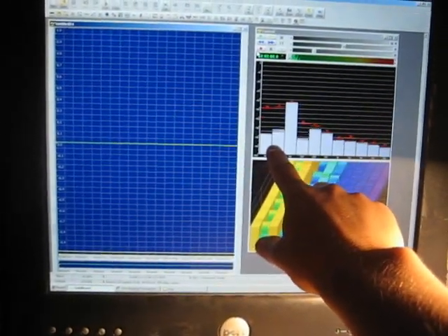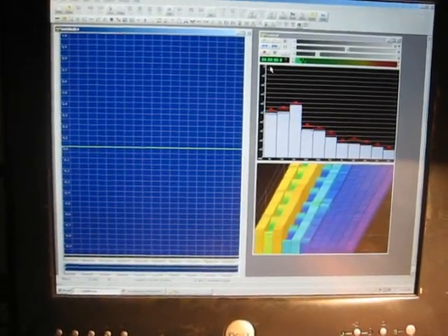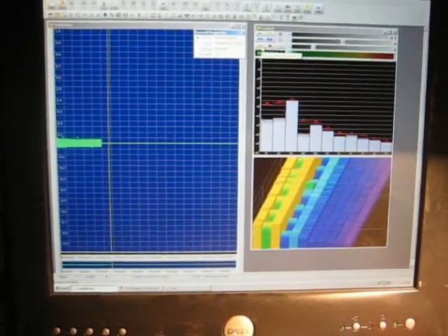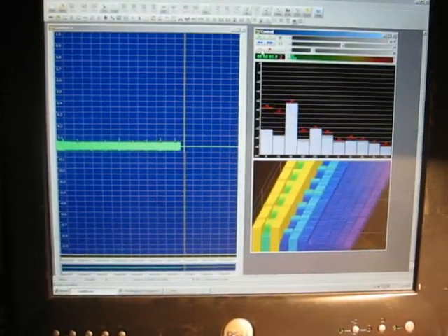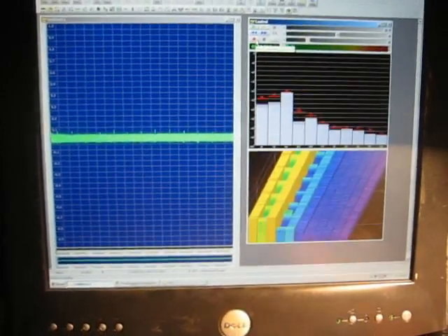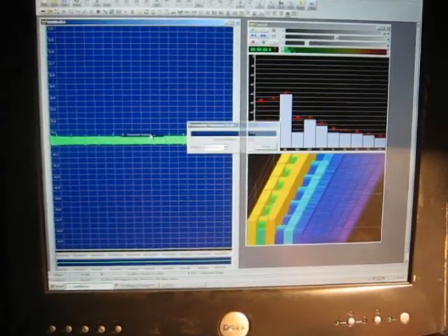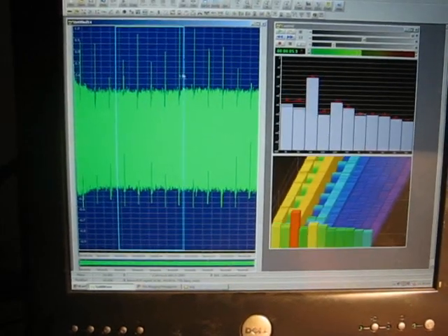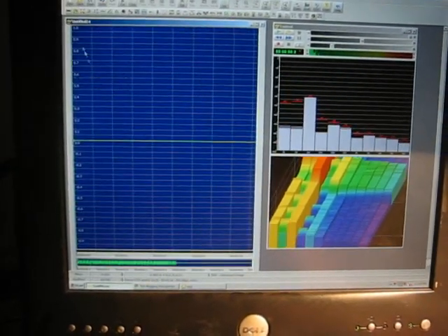Here you can see these lower two bars correspond to my heartbeat, and this is just audio editing software. It's called Gold Wave. I'll record a small region of my heart, and now I'm just recording. It's a sound file, just like anything else. And I recorded 10 seconds of it. Now I'm going to do two things. The first thing I'm going to do is edit the volume and maximize the volume. The next thing I'm going to do is select a small region and then trim that region out.